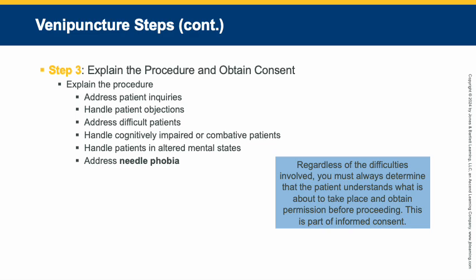If so, consent for those procedures may need to be obtained from a guardian of this patient. You may also need to enlist the help of one of the patient's caregivers to assist you during the blood draw, like maybe their nurse. You also want to make certain you have an unobstructed exit route in case it is needed. Be mindful of where you place equipment. Keep it out of reach of the patient.